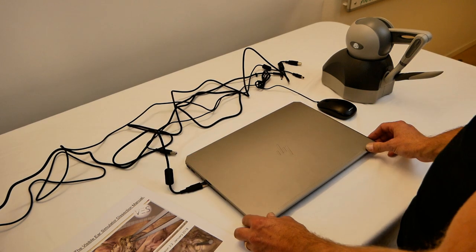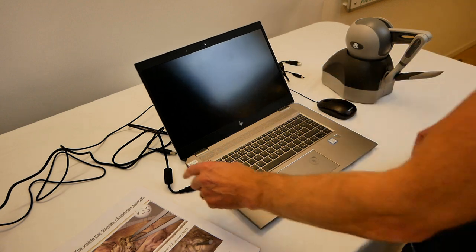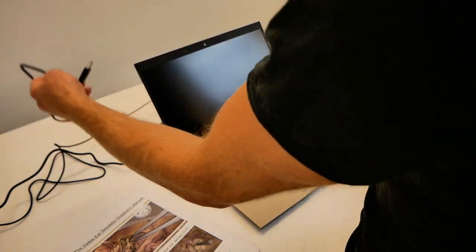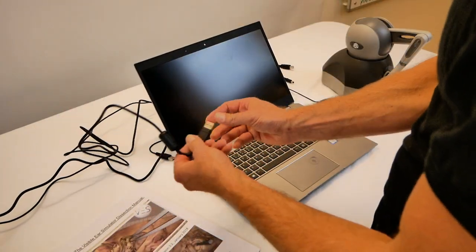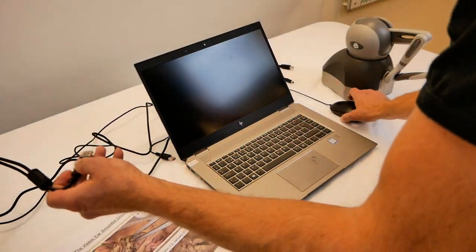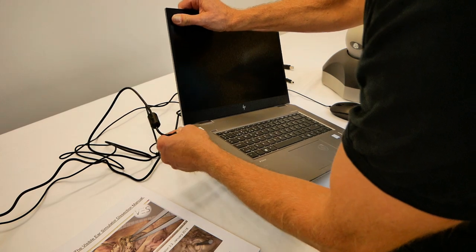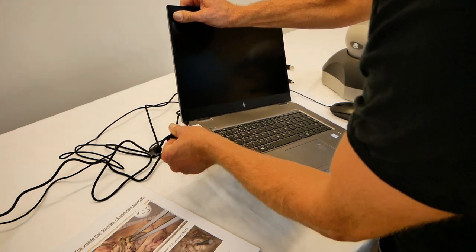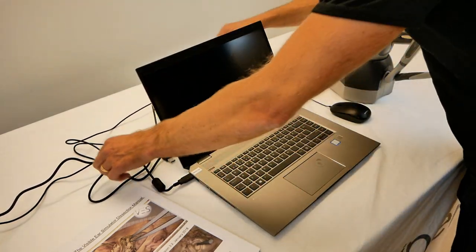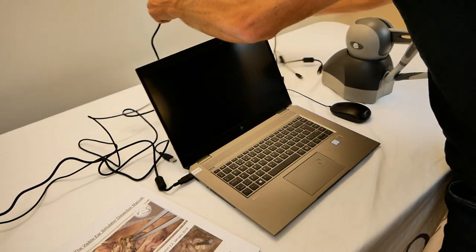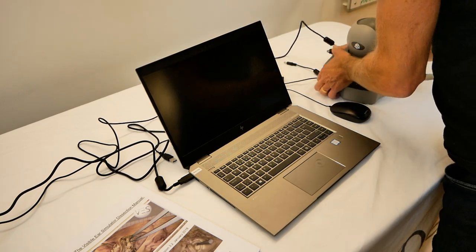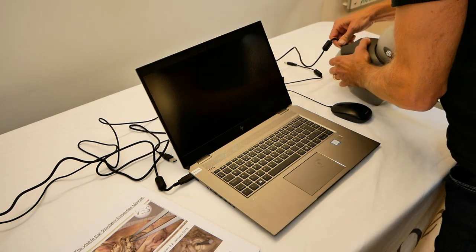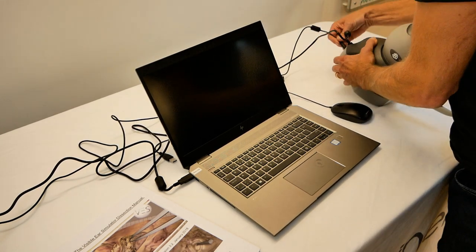So I will start by connecting all the hardware. We have the USB cable for the haptic device. It goes into the computer as well as into the haptic device.